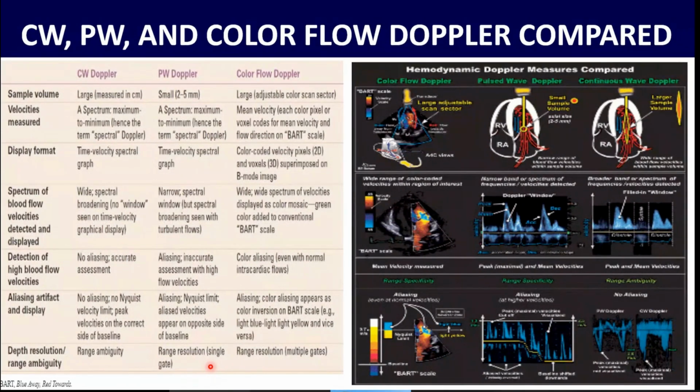When you talk about the left ventricle, we have the lateral myocardial velocity and the septal velocity. These values range from 8 to 10, 8 to 12 centimeters per second. The same thing can be applied for the right ventricle, and the S wave velocity is an indicator of systolic function, whereas the diastolic waves E prime and A prime represent the diastolic function.